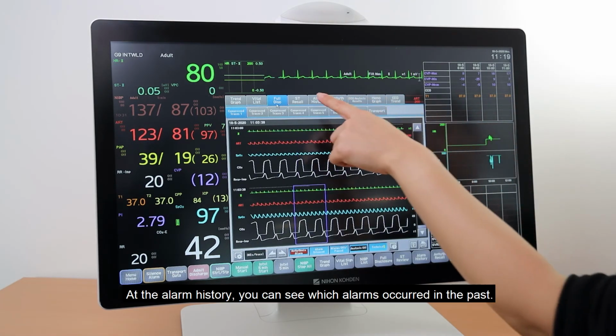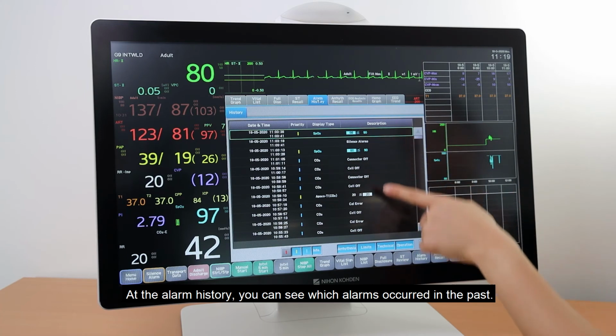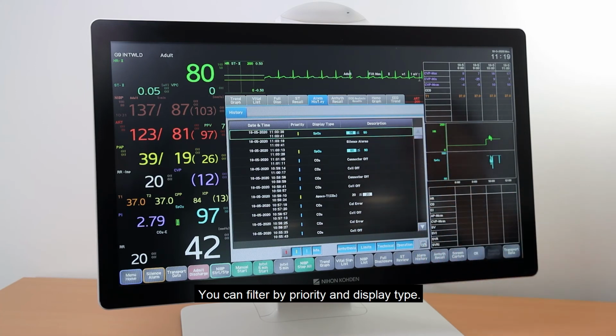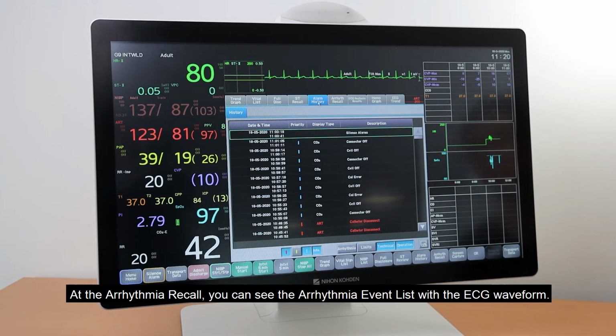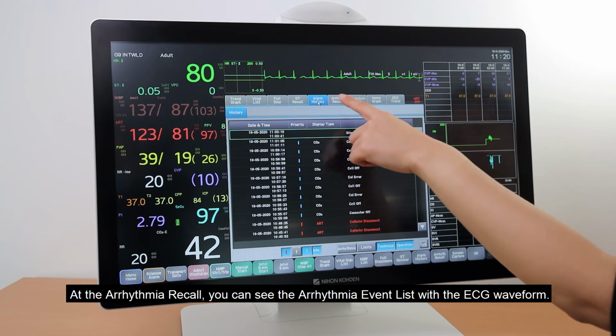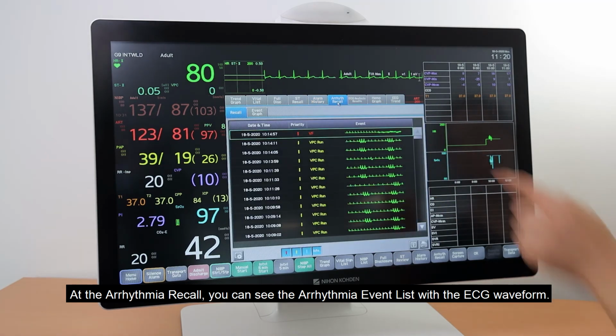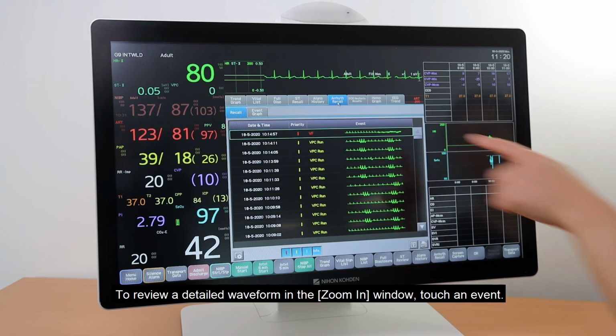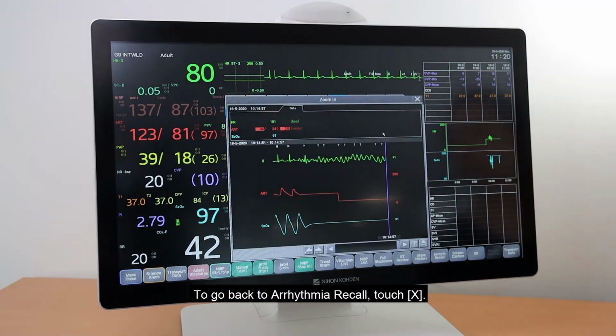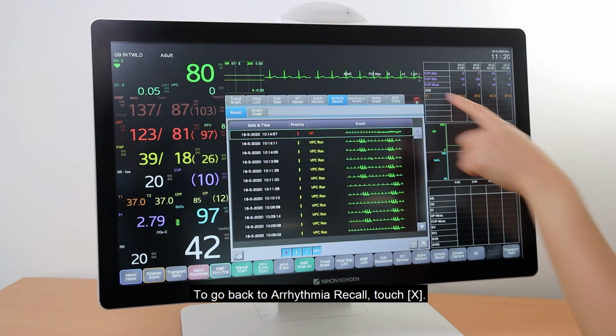At the alarm history, you can see which alarms occurred in the past. You can filter by priority and display type. At the arrhythmia recall, you can see the arrhythmia event list with the ECG waveform. To review a detailed waveform in the zoom in window, touch an event. To go back to arrhythmia recall, touch X.